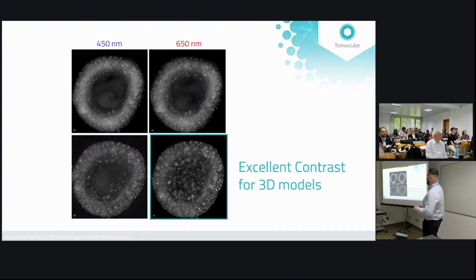That's just a quick difference between the blue light versus the red light due to the penetration. Of course, the blue one is going to give you the highest resolution, but the red one is going to give you more information in there.